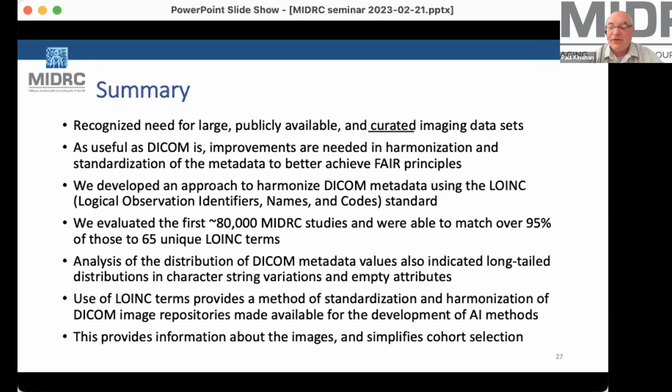And we talked about having a MIDRC data quality certification and things like that. And we ran smack dab into the question, how do we find the studies if we can't read the study description? And so we had to pivot to this metadata on the informatics side, which is why I was kind of kidding. I'm trying to copy your career now and learn at least a little bit about informatics.